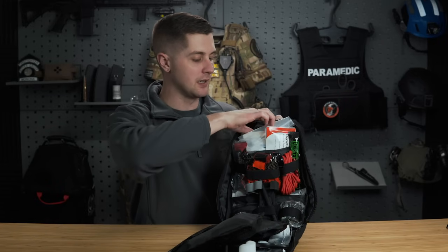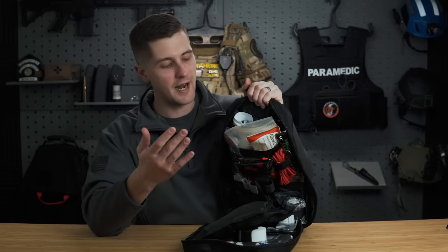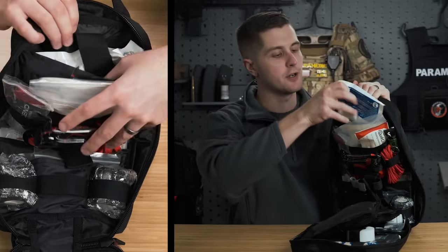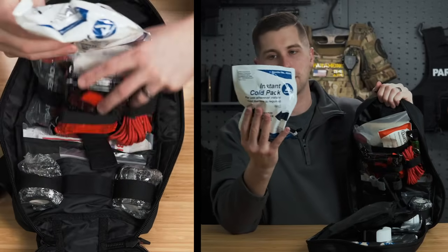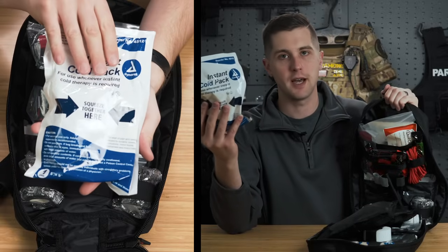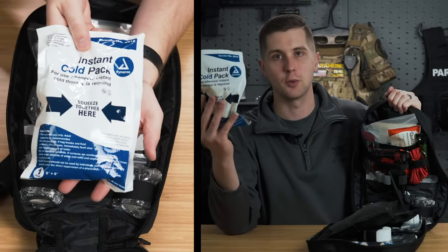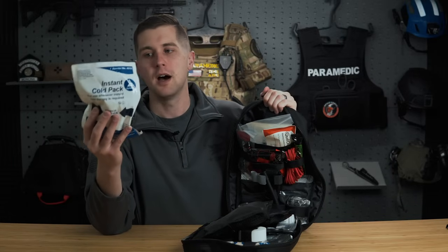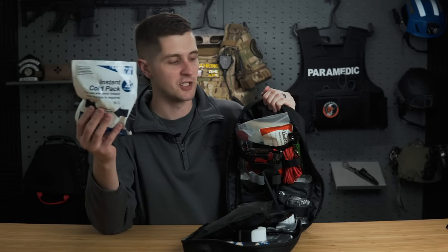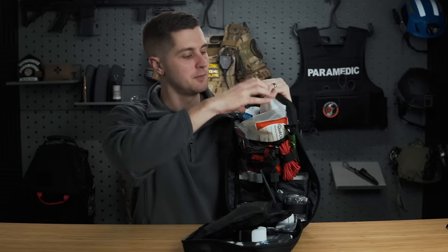Now at the top of this kit, we have a couple different things, and this thing has pockets everywhere, to the point where it can actually get hard to find certain pieces of equipment. So right here, I've got an ice pack. Like I said, this is stuff that I'm not going to keep in a tactical kit, but when you have a kid or somebody bumps their head or they have a bee sting and you want to just control the swelling and the pain a little bit, an ice pack's a great thing to have. And this is really easy to do. Obviously, these things go bad over time, so you have to make sure that these aren't hitting their expiration dates.